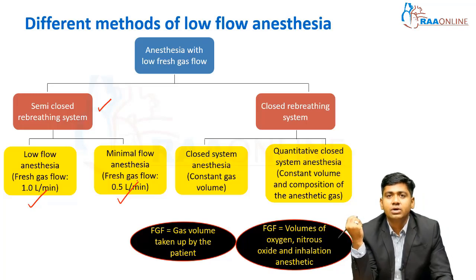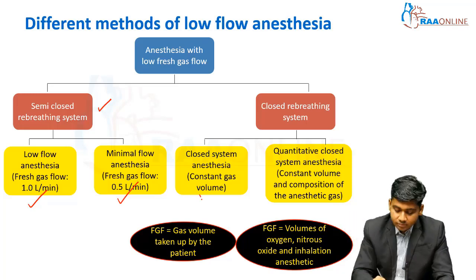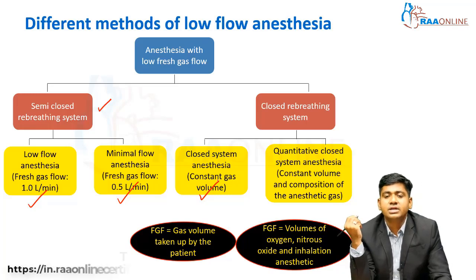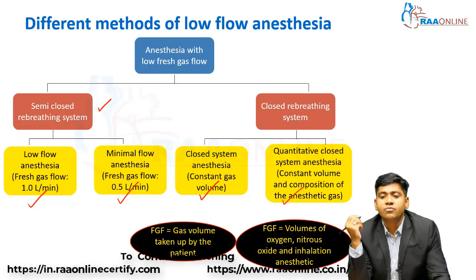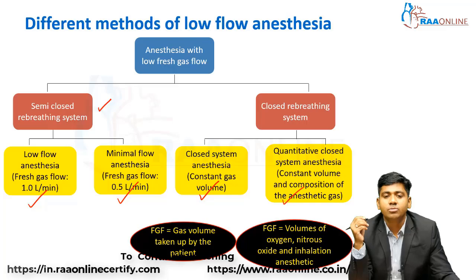minimal flow anesthesia with fresh gas flow around 500 ml per minute, closed system anesthesia where we give a constant gas volume, and quantitative closed system anesthesia where constant volume and composition of anesthetic gases are delivered. This is the classification or methods of low flow anesthesia.